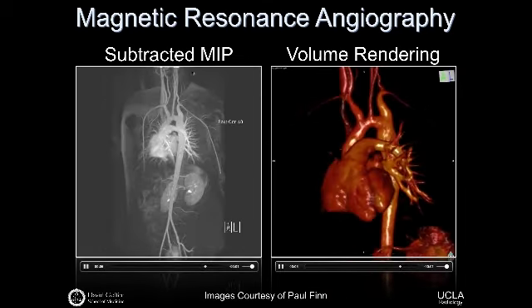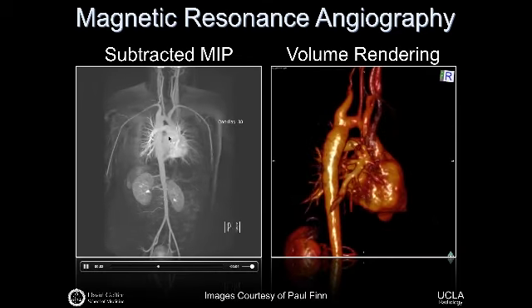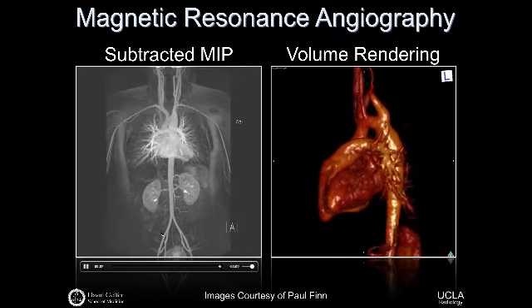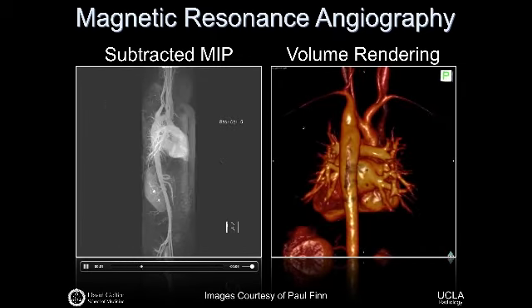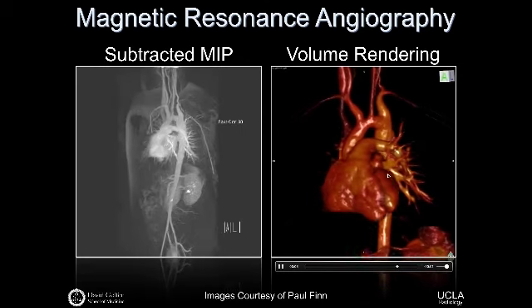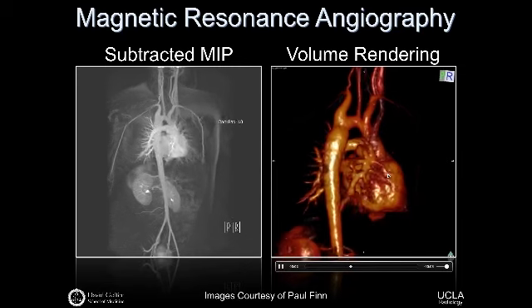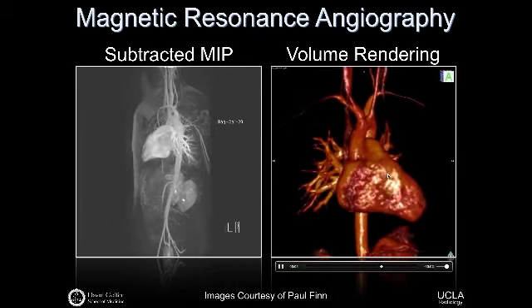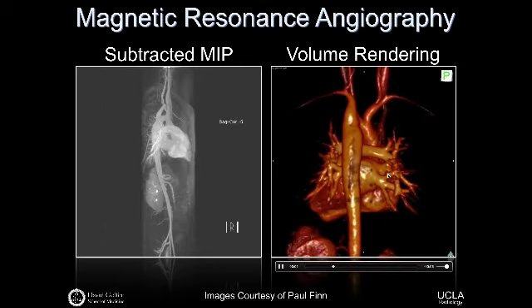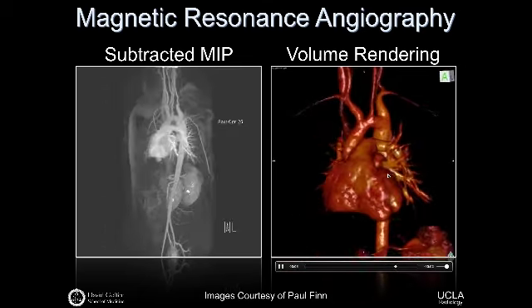So subtracting those images from one another, the pre-contrast and the post-contrast, you obviously highlight the brightest tissues and can effectively get a good roadmap of the underlying vasculature. Or you can do some fancier things with some volume rendering and tools like, in this case, Osirix, and actually get a surface volume rendering of the vascular anatomy and maybe see things even more clearly. So nice application here of 3D gradient echo imaging, which is a fast T1 weighted sequence in this case.